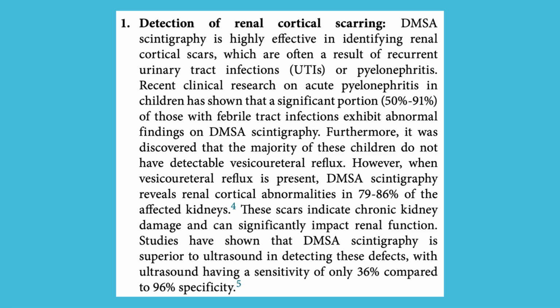These scars indicate chronic kidney damage and can significantly impact renal function. Studies have shown that DMSA scintigraphy is superior to ultrasound in detecting these defects, with ultrasound having a sensitivity of only 36% compared to 96% specificity.